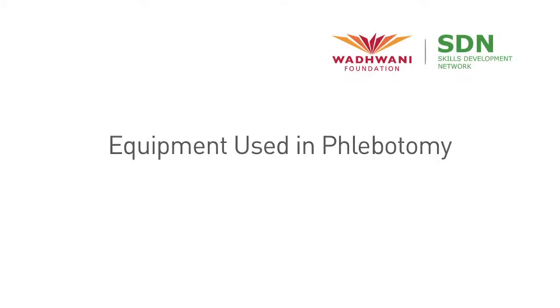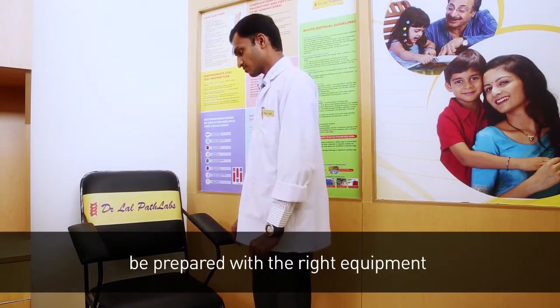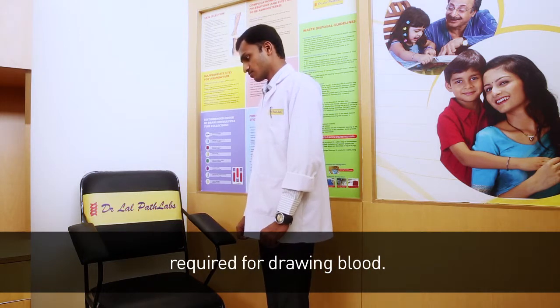Welcome to a video on equipment used in phlebotomy. This video is brought to you by Wadhwani Foundation. An efficient phlebotomist will always be prepared with the right equipment required for drawing blood.